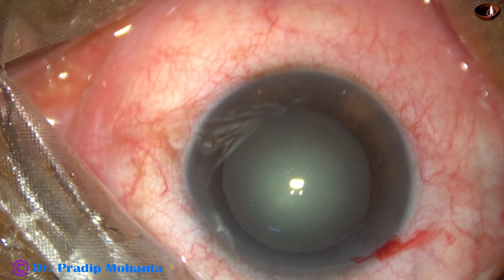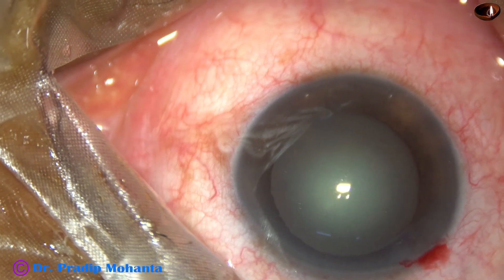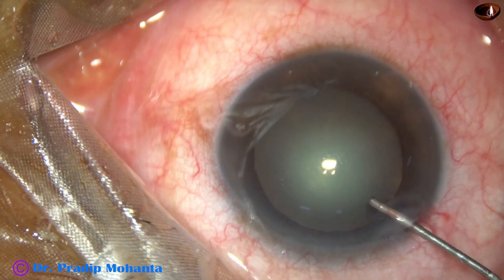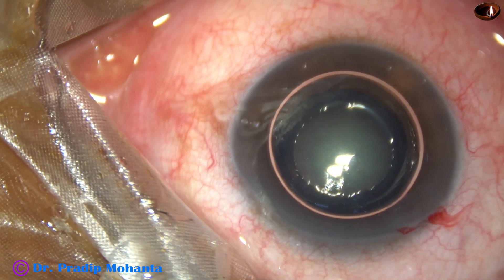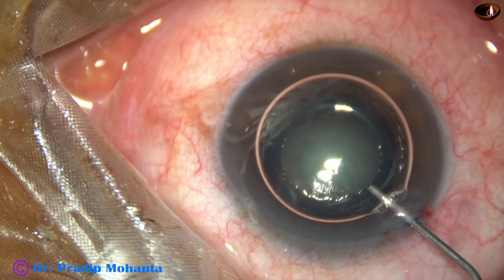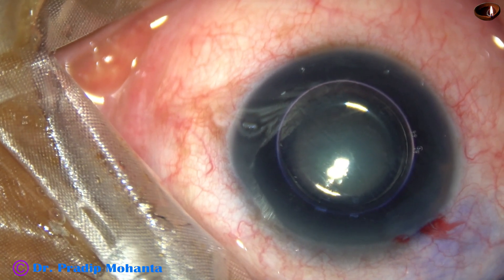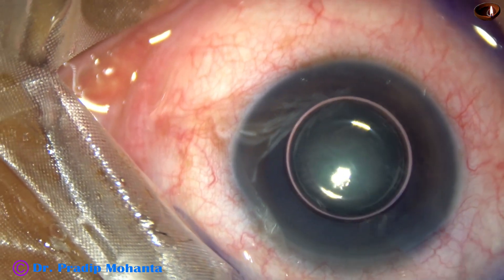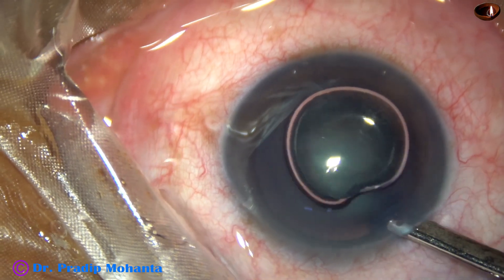Beginners should use trypan blue dye to stain the anterior capsule. An air bubble is used to fill the anterior chamber and then trypan blue dye is applied over the anterior capsule. The dye is applied on all parts of the anterior capsule for uniform staining. This is a bit of adrenaline.